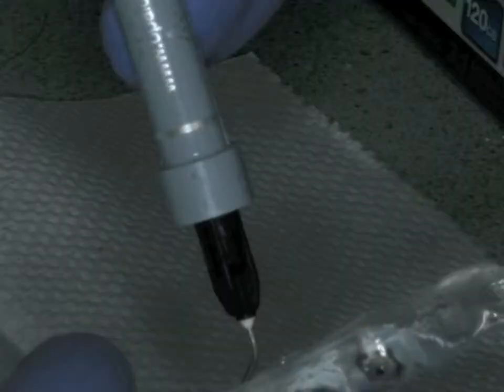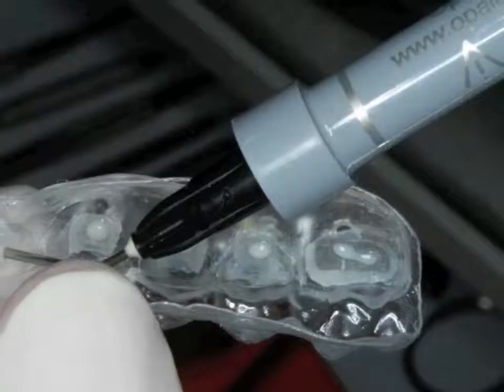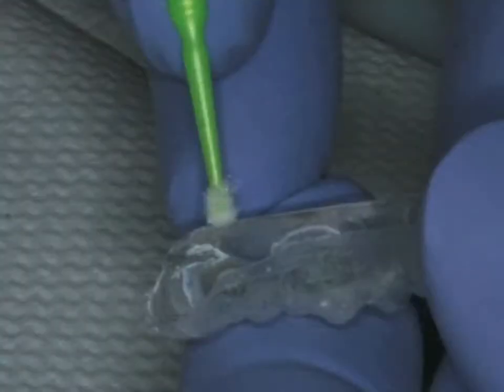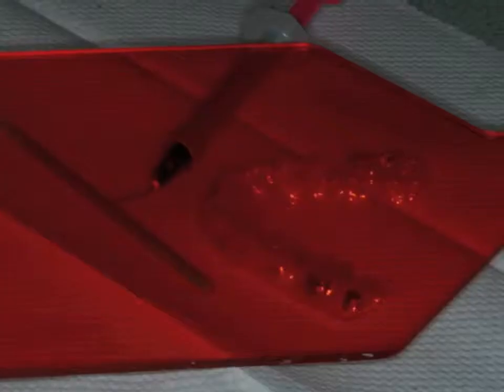The brackets are coated with a thin layer of Opal Bond Flow flowable adhesive, then thinned with a micro brush. This final coat should not be done until the patient is seated to prevent ambient light curing, but the light shield is helpful.